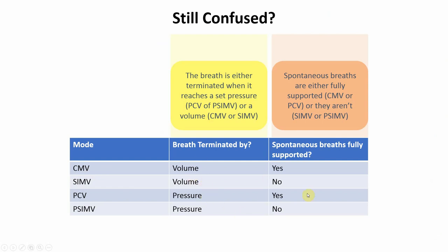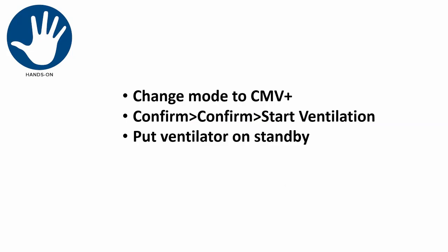by volume or pressure. So the breath is either terminated when it reaches a set pressure or a set volume, and the spontaneous breaths are either fully supported or they're not. So let's see what this looks like on a ventilator.